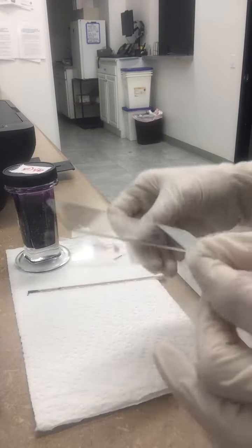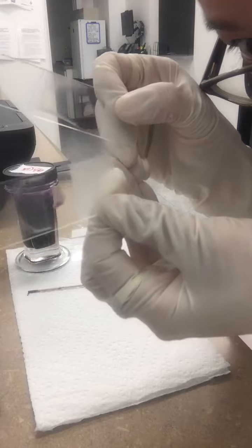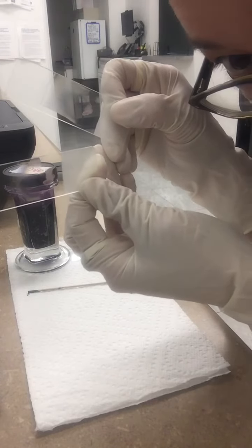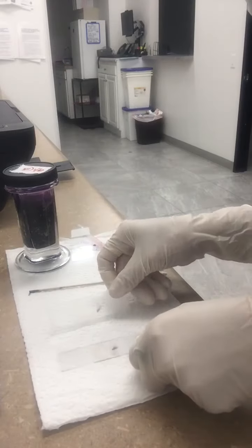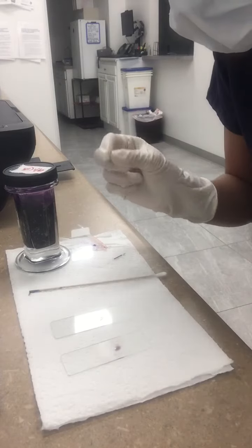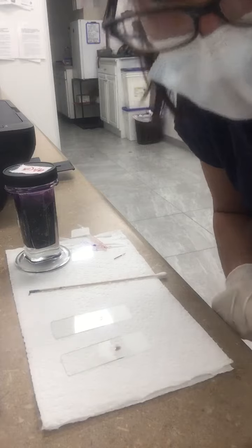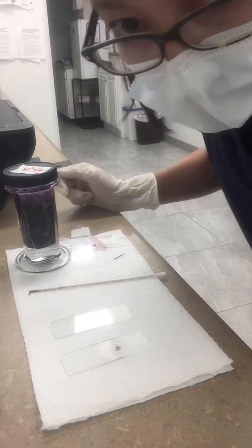Let me see if I can get it close — you can see my two blood smears for our reticulocyte count. The next step would be to apply immersion oil and examine this at 100 times under the high power field. And that's a blood smear for a reticulocyte count.